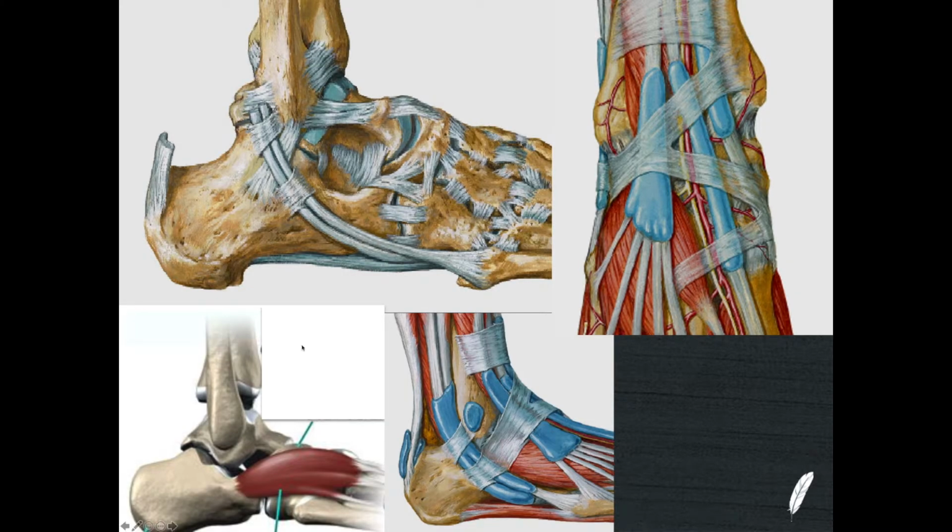Another piece of anatomy that's very, very close here is this muscle belly here, which is extensor digitorum brevis. And extensor digitorum brevis, so this is it here, and this is it here underneath the extensor digitorum longus. This muscle has its origin in this area here. So it attaches onto the calcaneum just ever so proximal to the origin of the calcaneo-cuboid ligament.